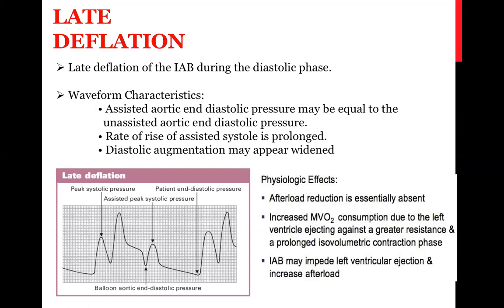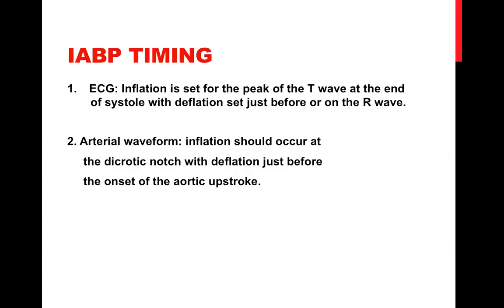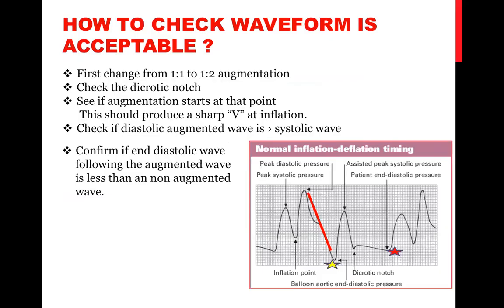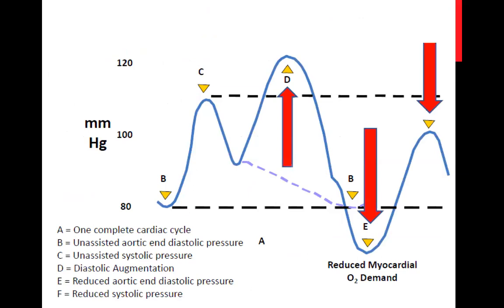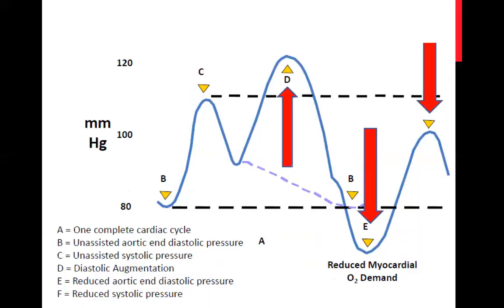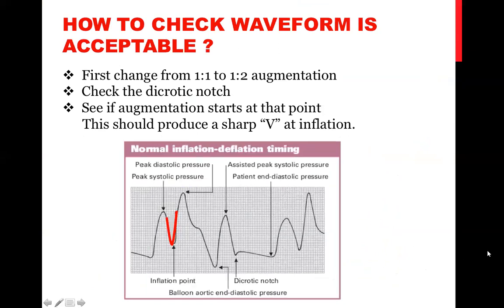بس هذه late deflation, هذا مو بالنورمال. If you put a normal one, مثلا one to one, it is better, it will be more. هذا يعني, this is abnormal. There was a slide that shows one to two, normal one to two. I don't know if you have it here. I don't think I have it. Go back to the balloon. Okay, you can stop here, please. هذا كويس شوف assisted and unassisted. Okay, so ask your question now, يا حكيم.